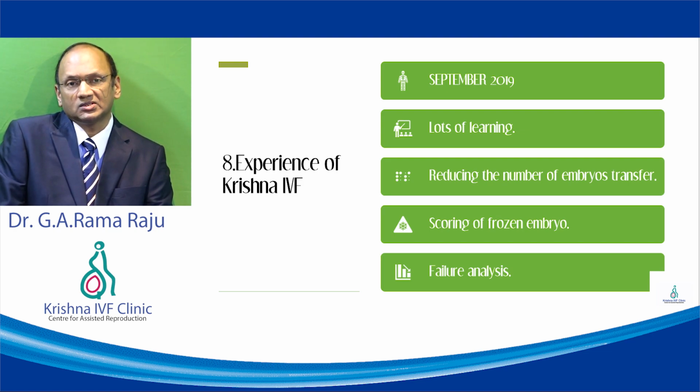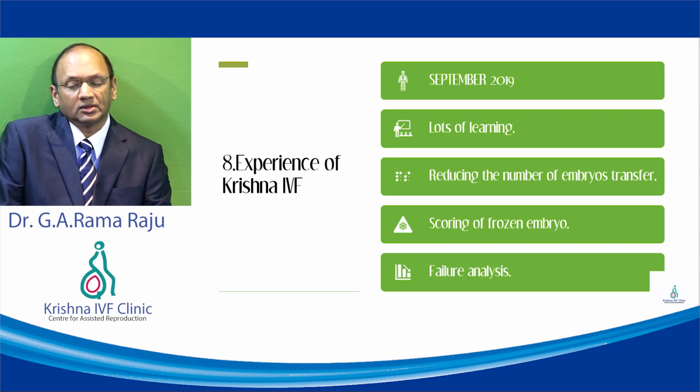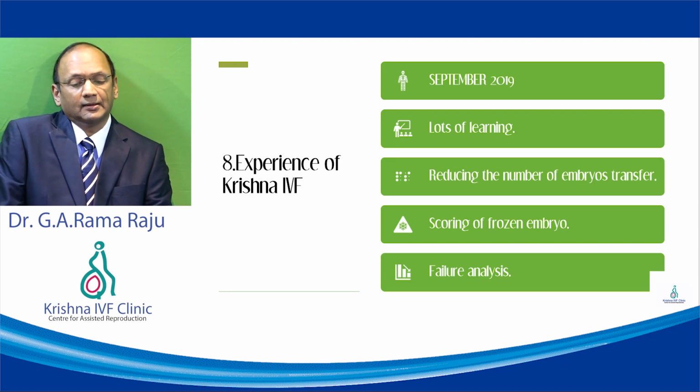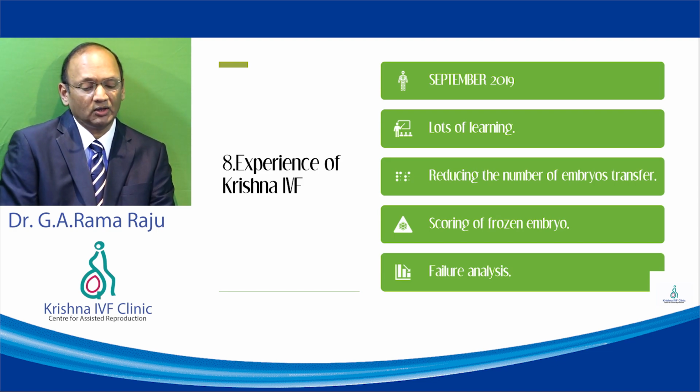Last but not the least, when a cycle fails, we are able to go back to the film and look at where things failed. So the failure analysis part is also helping us. If the embryo is perfectly fine, then I might look at immunological causes or uterine causes as a cause for failure.